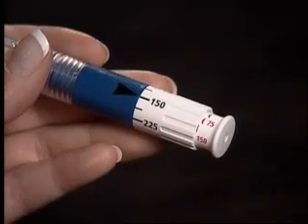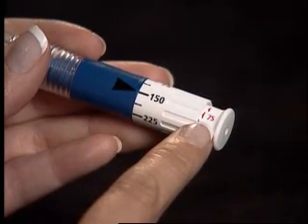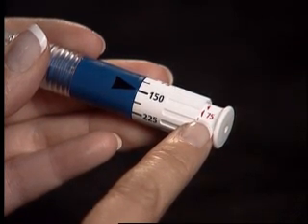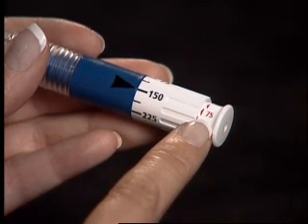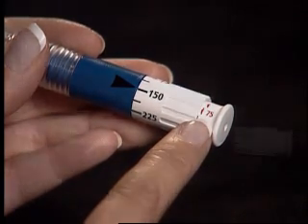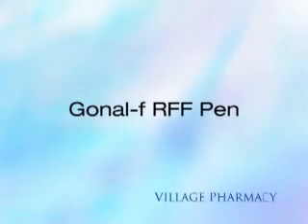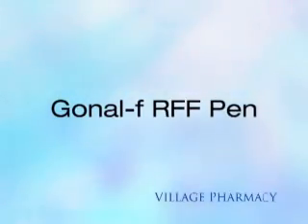Please note: when loading your initial dose, if the loaded dose is lower than the amount lined up with the black arrow, then there is not enough medication in the pen. In this scenario, you will need 75 international units in order to complete your dose. Remember, each new pen needs to be primed. Repeat your injection instructions. Store your pen with your supplies for future use. This concludes the subcutaneous injection instructions for Gonal F RFF Pen.